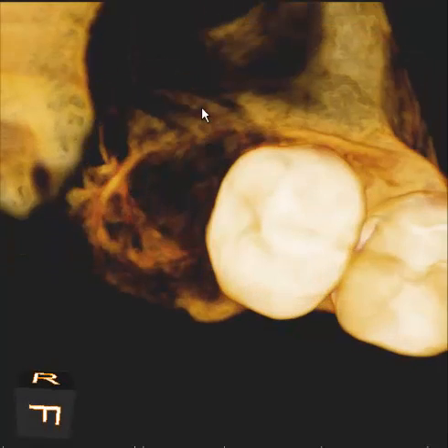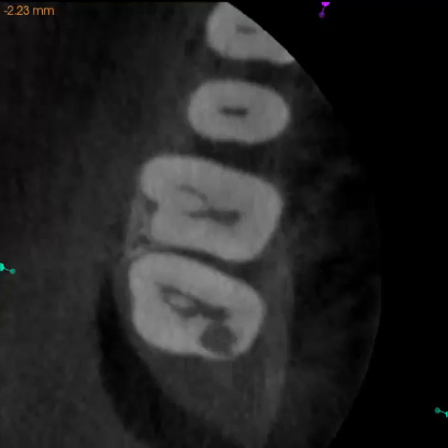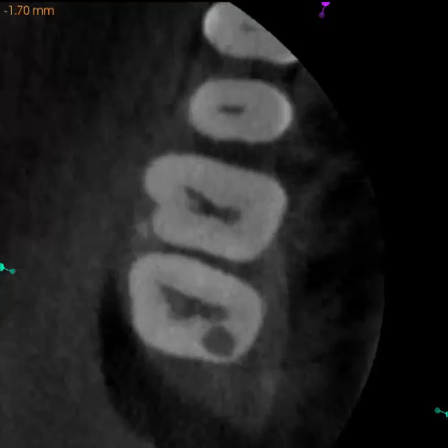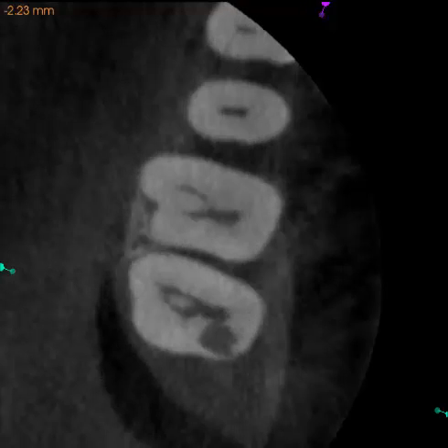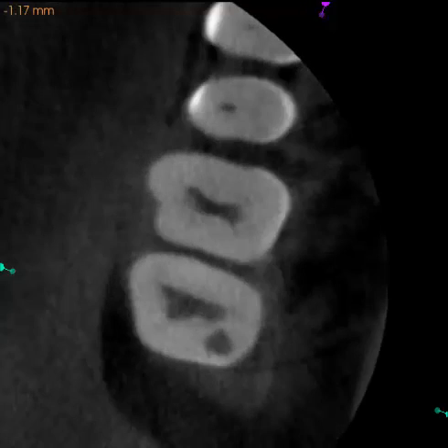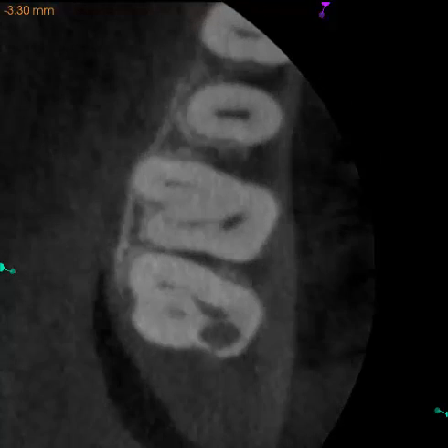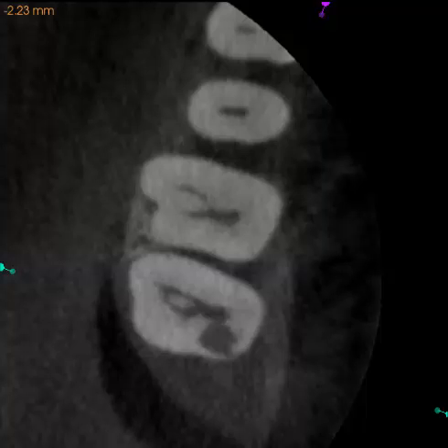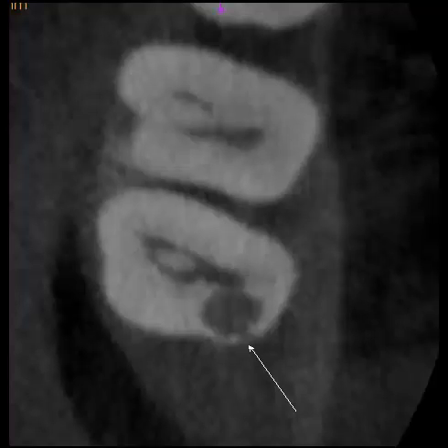Now, dynamically slicing through the transverse sections shows us the peripheral extent of this lesion and a very good clue where the osteoclasts are actually entering and breaking through the root surface.